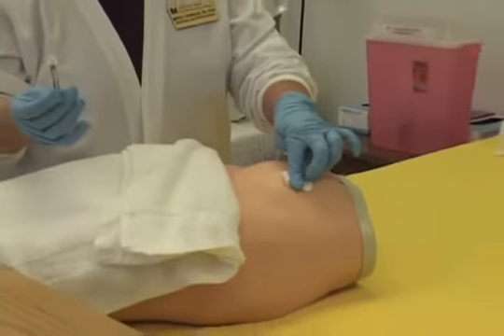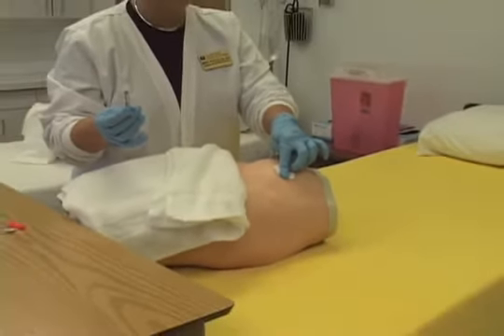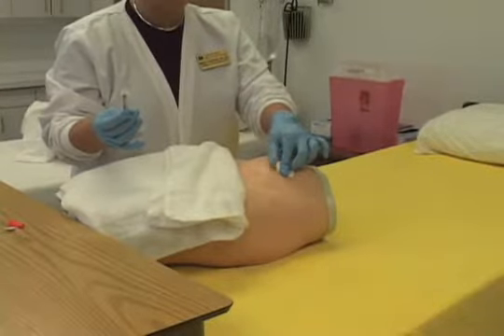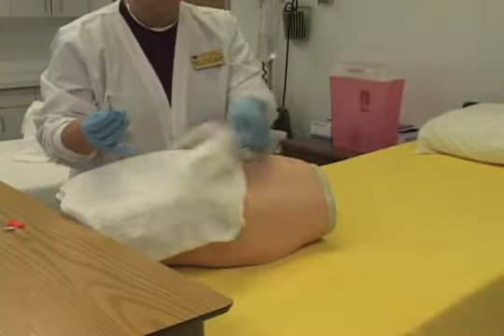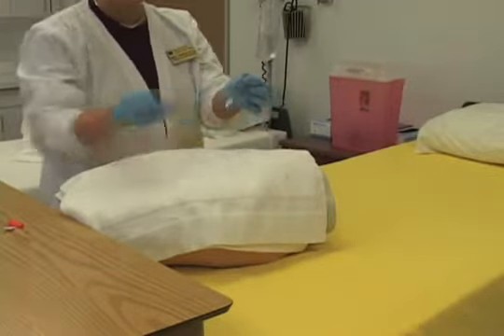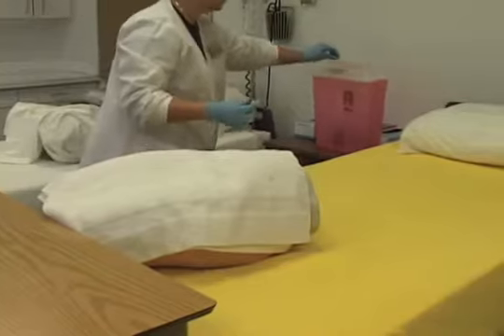Apply gentle pressure to the injection site with an alcohol wipe or gauze pad. Do not recap the used needle. Activate the safety shield. Discard the needle and syringe in the sharps container.